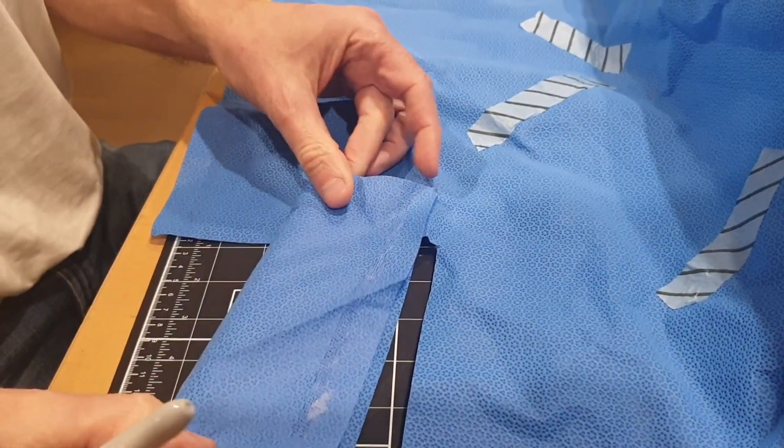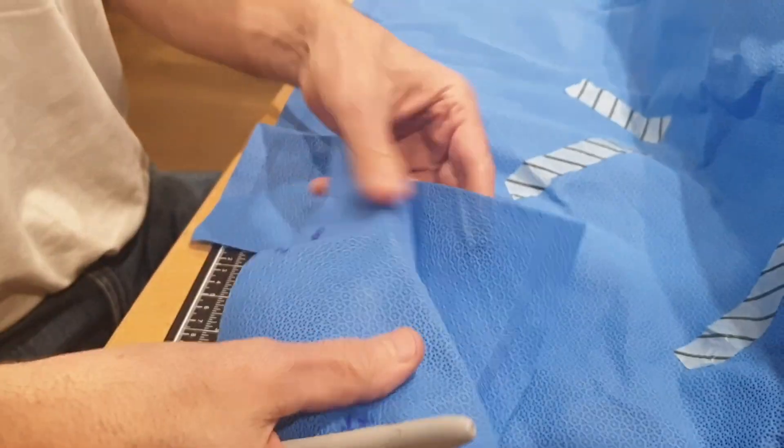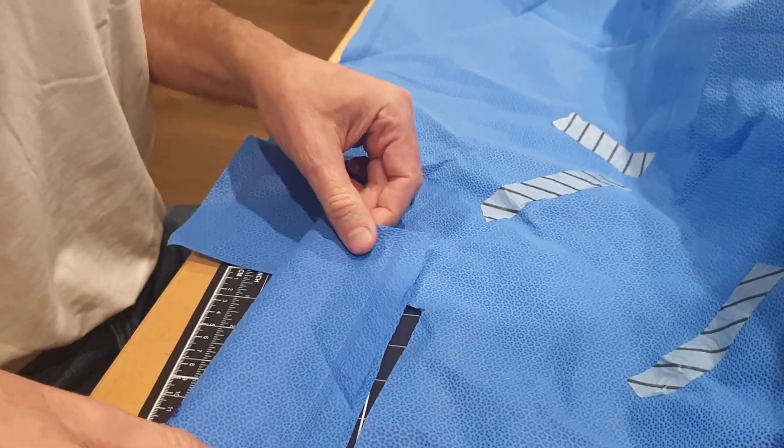Fold the material in half lengthways and then make a hole in both three corners, ideally with a hole punch.